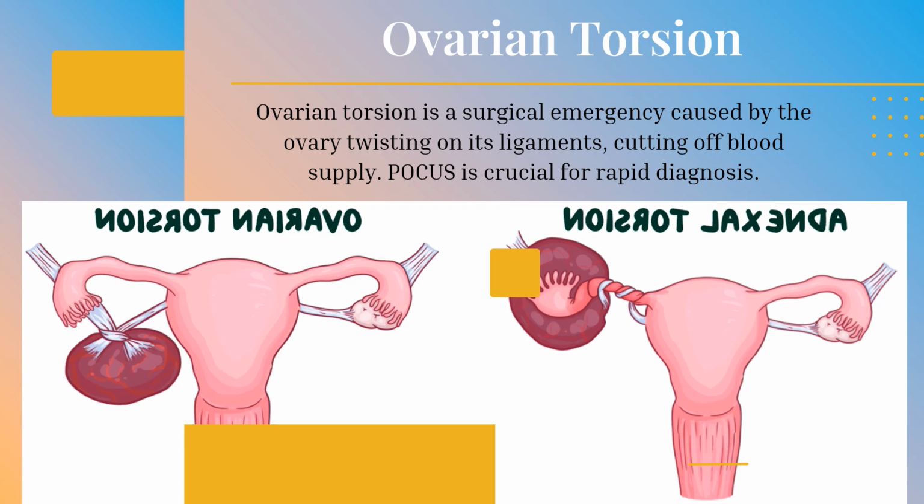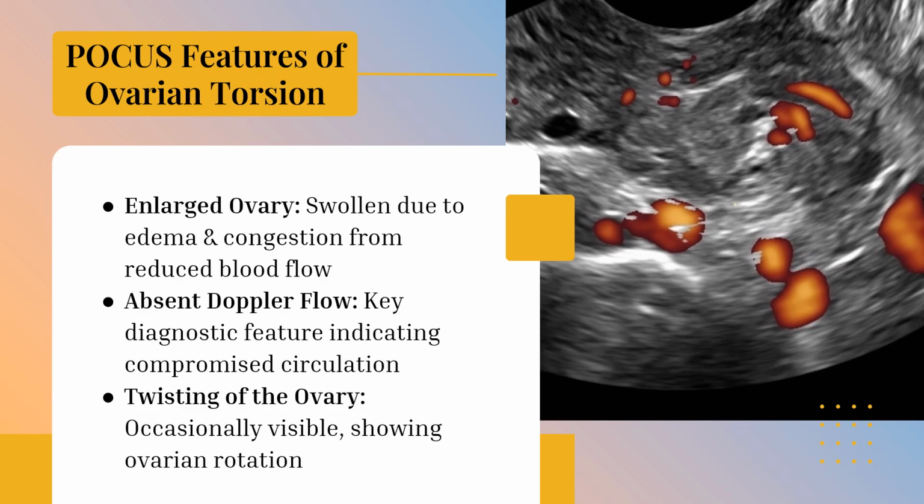So this would be more of an urgent care or emergency room situation. Someone comes in with severe pelvic pain and you need to evaluate quickly. Especially in rural settings, you may not be able to get the ultrasound tech and the radiology department to see them right away, so you grab the ultrasound machine down the hallway and quickly determine if there's loss of blood flow to the ovaries to rule out ovarian torsion.